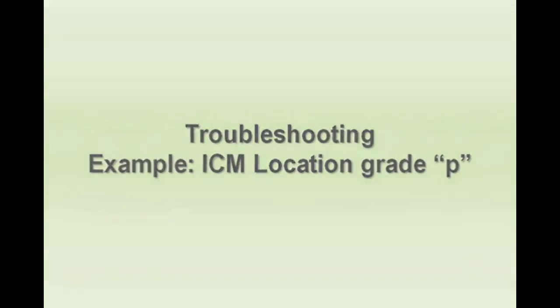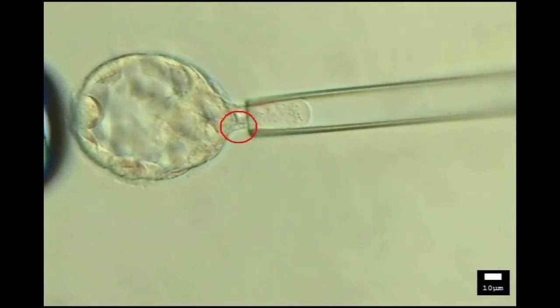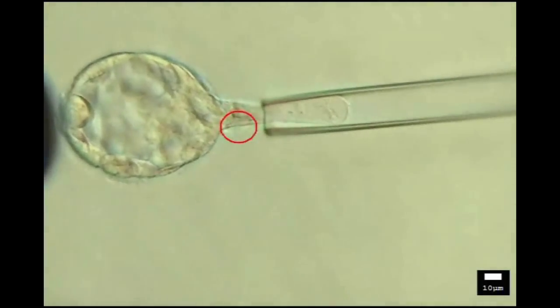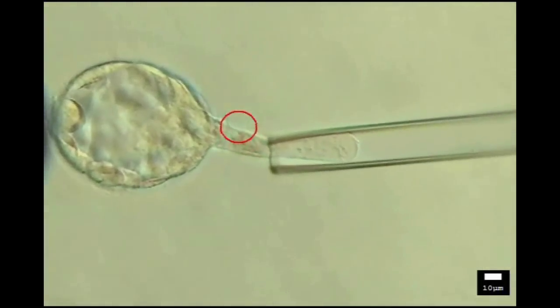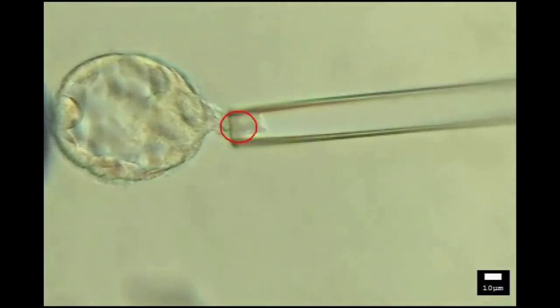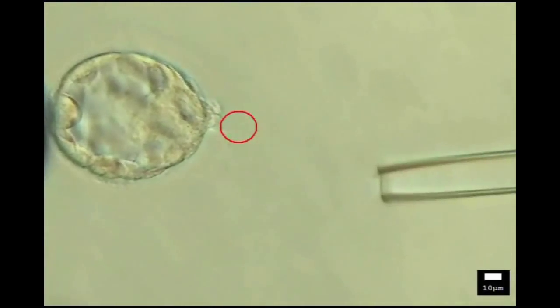A troubleshooting example: ICM location grade P. Note the trophectoderm is pulled away from the ICM to allow the first laser pulse. In this example, a small piece of trophectoderm is released, leaving a second piece behind. The second piece is easily biopsied and both are sent for array analysis.